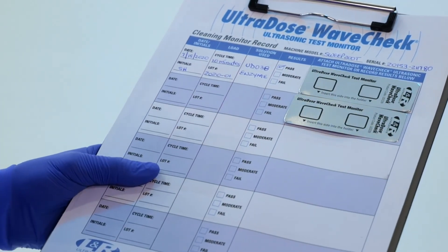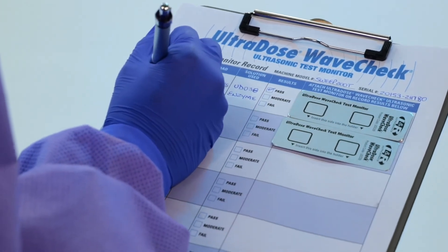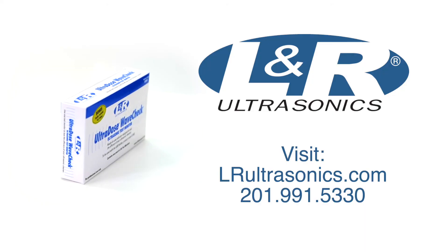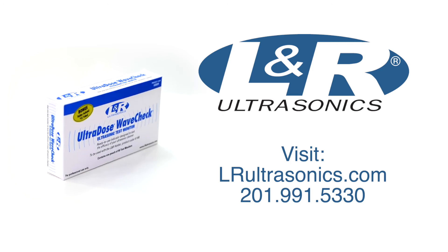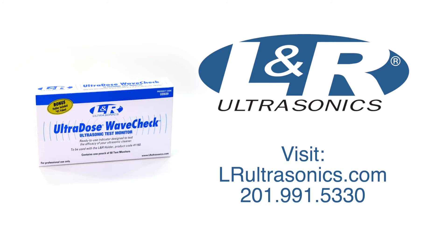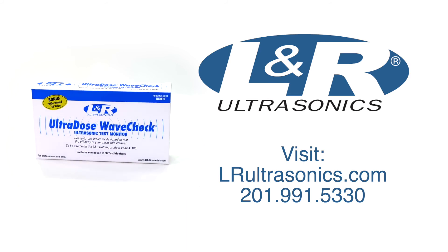Testing daily at the beginning of the day or when using fresh solution will help confirm your unit is performing properly. For more information, please visit us at LRUltrasonics.com or call us at 201-991-5330.